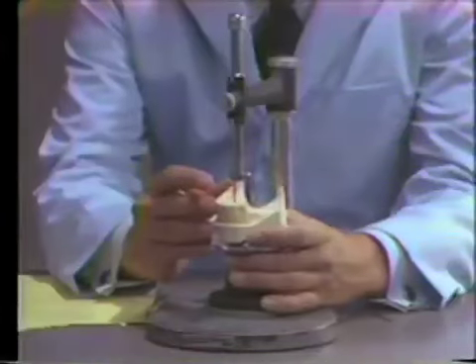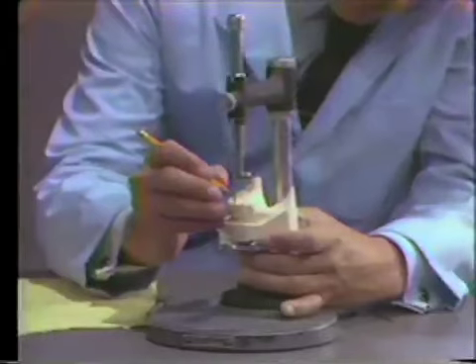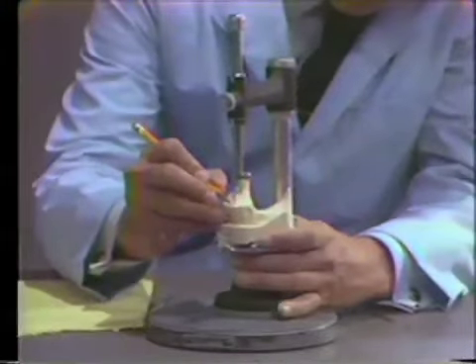To delineate this mark from the other marks of the height of contour that we've already made, we'll put an X and a circle around that to make sure that we know that is one of the tripod marks. Now we'll do that on 3 of the marks that we've selected. The other is this area in the anterior where the incisal edges are. And then we'll pick the 3rd point.